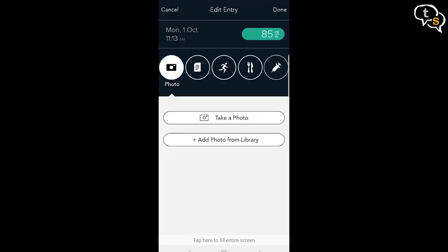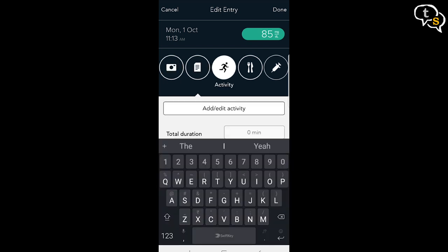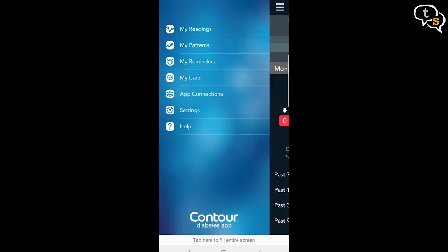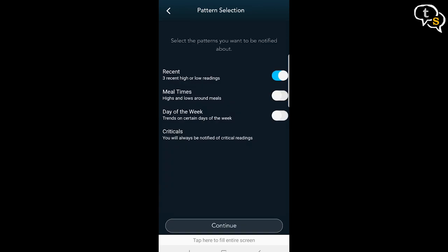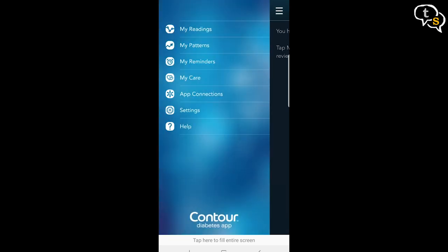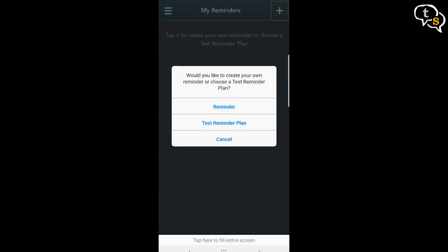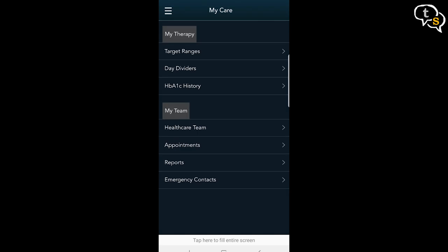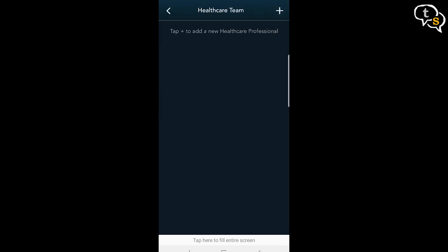You can tap on a reading and add photos, notes of the activity at that time, meal information, and any medications taken. The Patterns screen displays the patterns in which sugar levels increased, decreased, and other info — this is generally the analysis of data taken from the device, and for this to work we need to have many more readings. There are also reminders to remind you to take medication, log information, and test blood sugar. The MyCare screen is where you can set the target ranges and add information on your healthcare team for emergency calls.